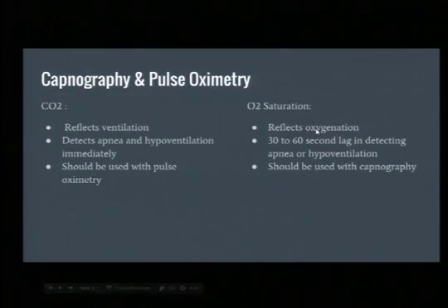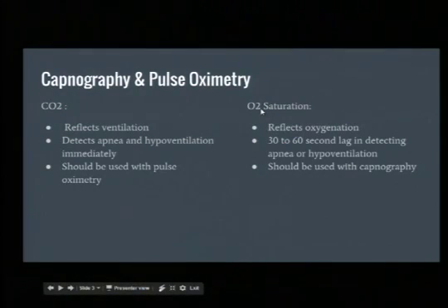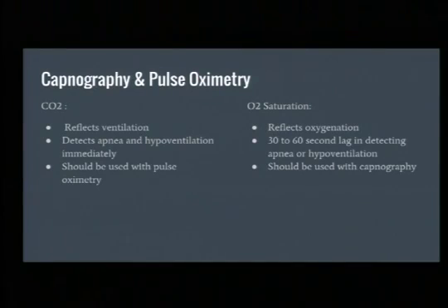Your CO2, which is what you're picking up, reflects your ventilation. You'll detect apnea and hypoventilation immediately, and it should be used in conjunction with pulse oximetry. Your O2 sat will reflect your oxygenation, where your CO2 monitor is reflecting your ventilation.